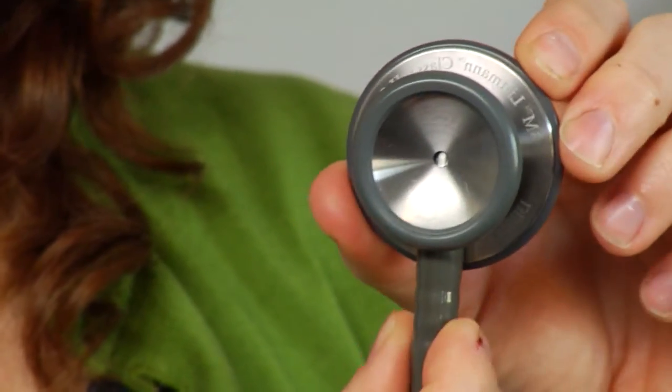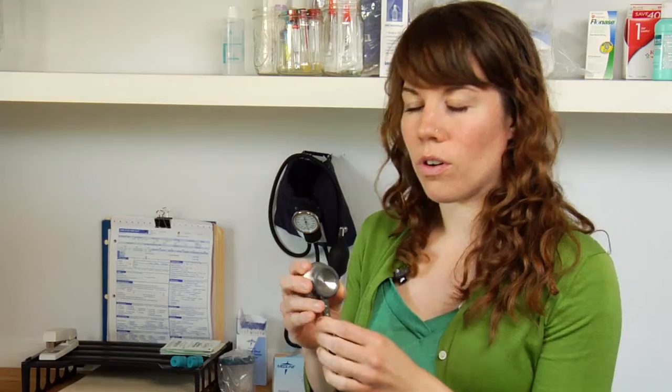So a lot of times, if you're in the ICU or you're doing general medical surgical or intermediate care, you're probably going to want a diaphragm as well as an open bell so that you can best auscultate both the lungs as well as the heart.